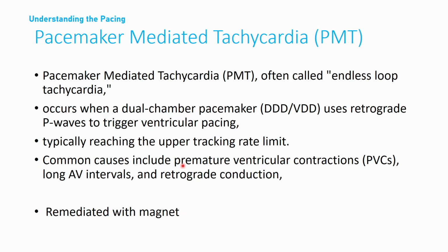So pacemaker mediated tachycardia is often called endless loop tachycardia. That's what madam says, this is endless loop tachycardia. So we have to stop it. If you don't have anything to stop it, then this will be there forever until the patient comes to the ER and something is done.